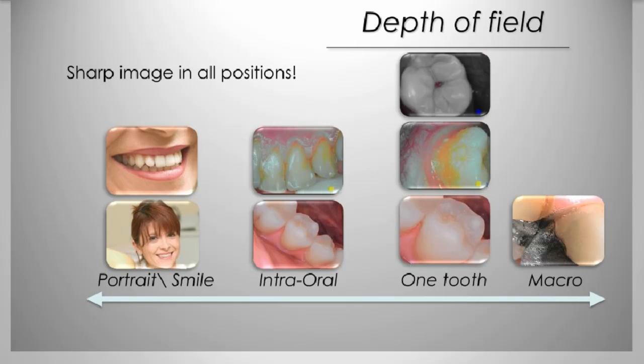The portrait or smile. The first, with just a picture of the patient here, this is great for patient recognition. A lot of offices are going to this. It confuses getting back the senior father versus the son that's in his 30s, and chart confusion and things like that. So this is becoming very popular.